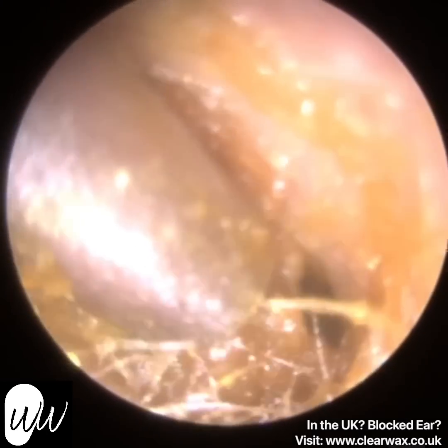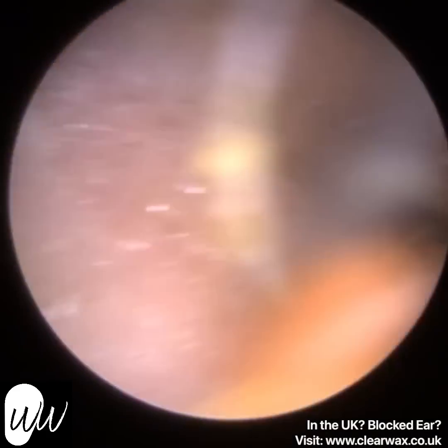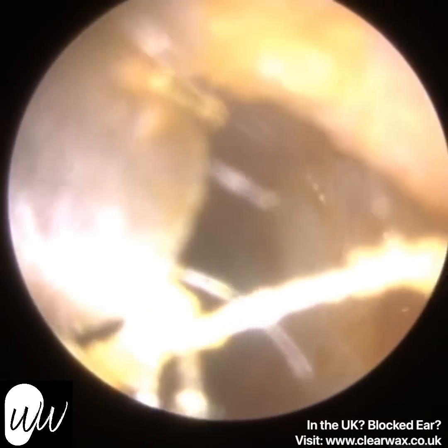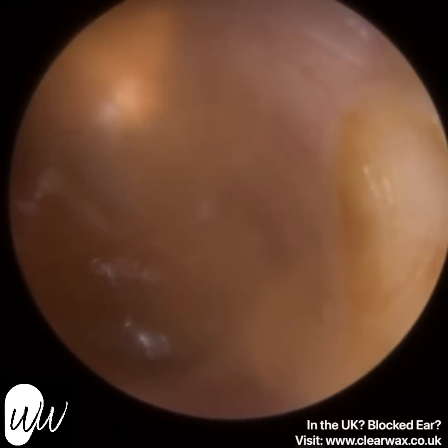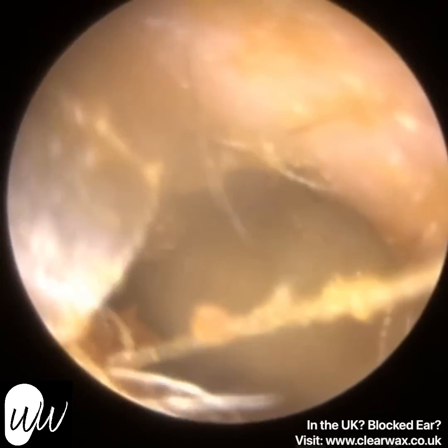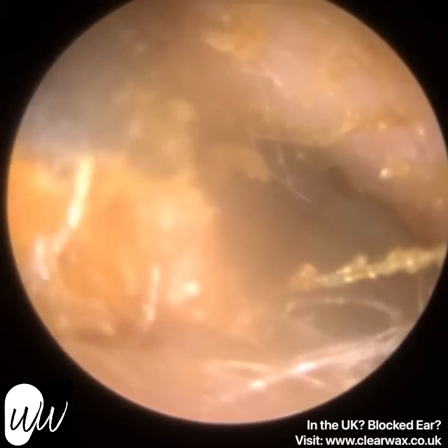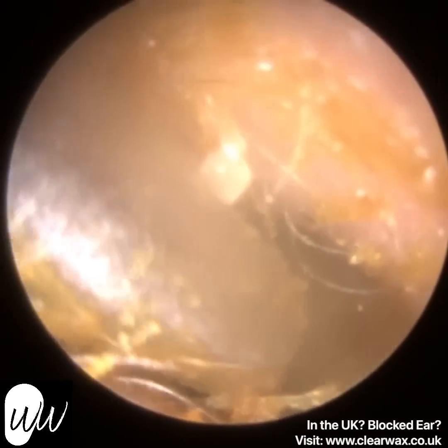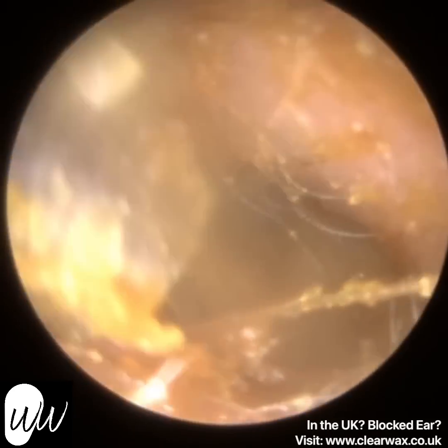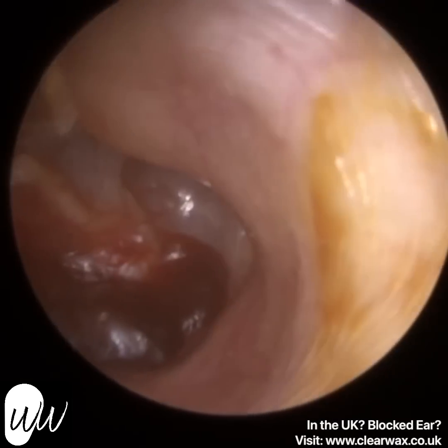So this is stored on the iClearScope. The iClearScope is the wireless endoscope that we've developed at Clearwax, and we use an iPod Touch 7th generation. The reason for the iPod, it's light, it's a separate device, but the memory's not as much. You can get different memories on them, but it's more commercially, because we obviously manufacture and distribute the device. The camera on the iPod 7 is more than suffice enough for earwax removal. And it's just commercially more affordable for our delegates who purchase it. It's more than adequate, but the memory is a bit smaller, and I've got so much there.